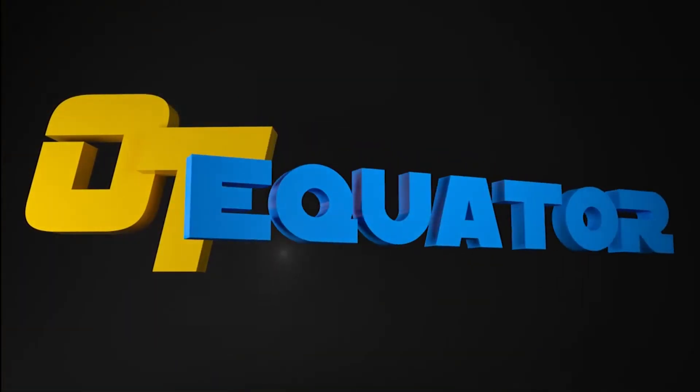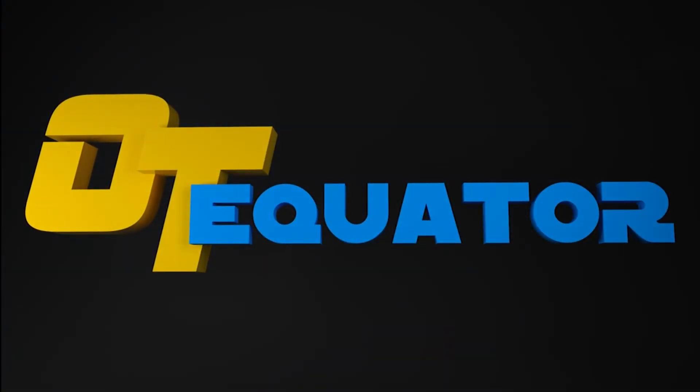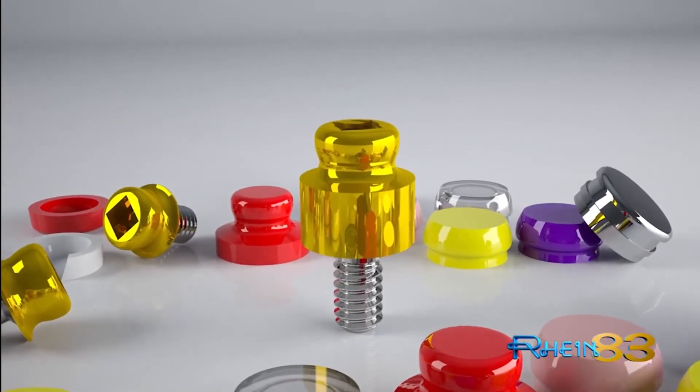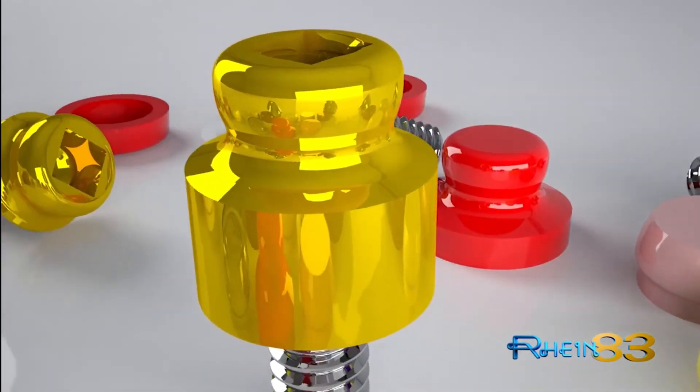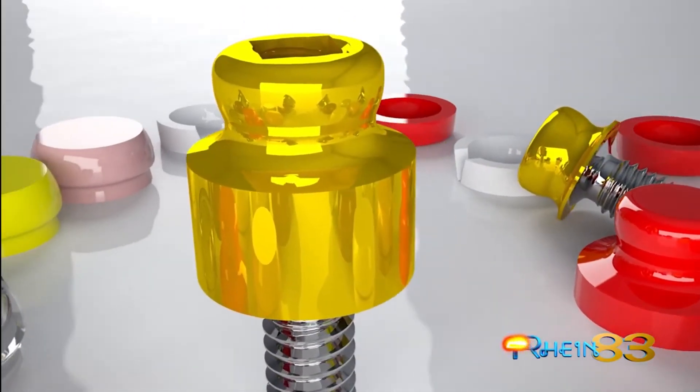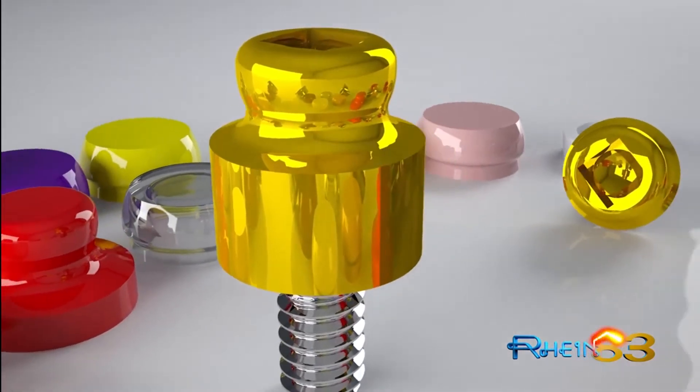The OT Equator — the new overdenture attachment featuring the lowest vertical profile. This new compact design with an internal thread will ensure multiple solutions for the most complex treatment plans, including those which demonstrate divergent implants.